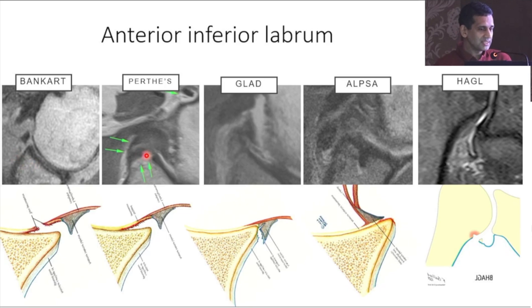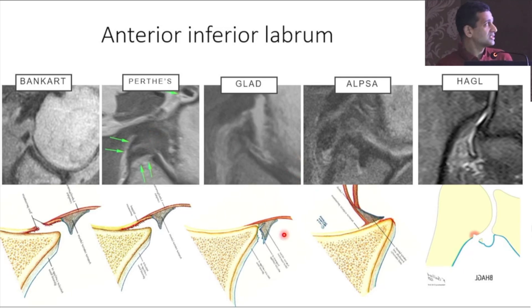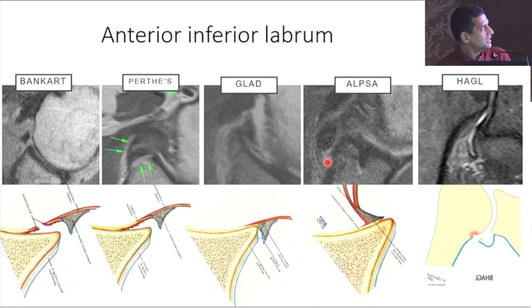You can see a Perthes lesion where the periosteum is stripped but the labral tissue remains in the same place. You can see a GLAD lesion — the happy one over here — where you can see there is cartilage loss, with cartilage coming off. And in this you can see an ALPSA lesion, where that periosteum is stripped and the labrum is buckled between the bone and the periosteum.